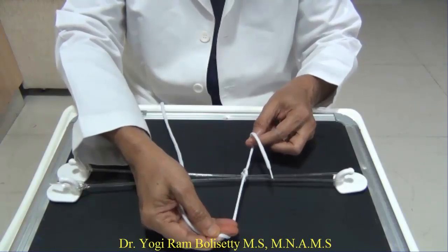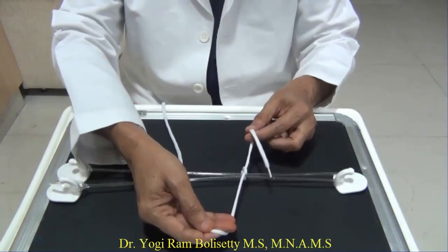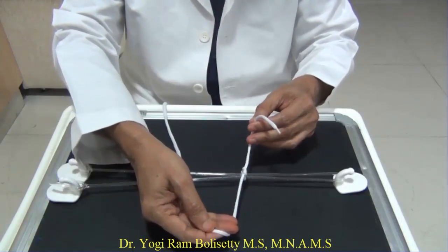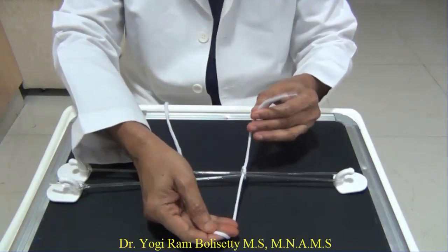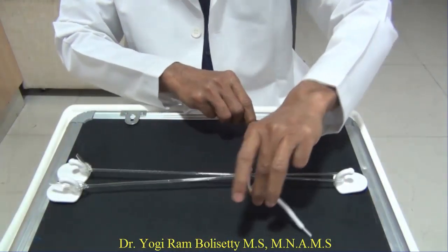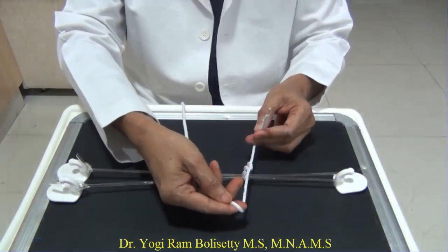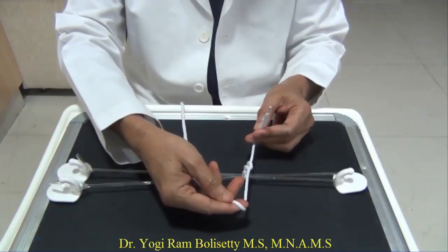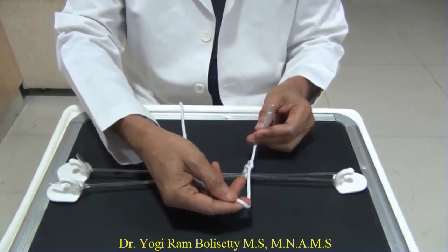This is how you form the reef knot, triple throw. If you are going to make a throw with synthetic material, either absorbable or non-absorbable, then you should have minimum 5 throws. So the fourth throw is just like the second throw. The fifth throw is just like the first throw. So there will be alternating index finger throw, middle finger throw, index finger throw, and middle finger throw. This is how you form the knot with your left hand.